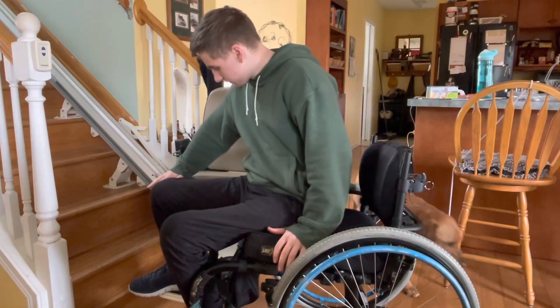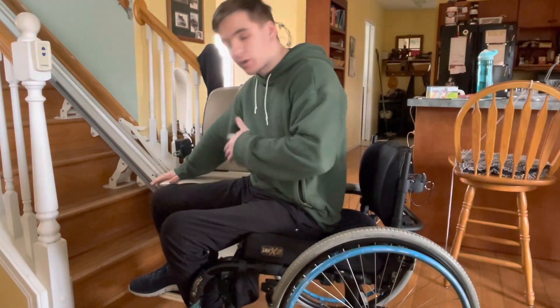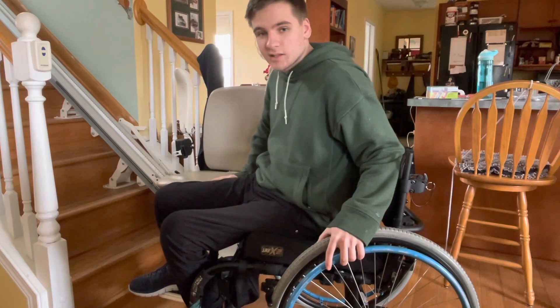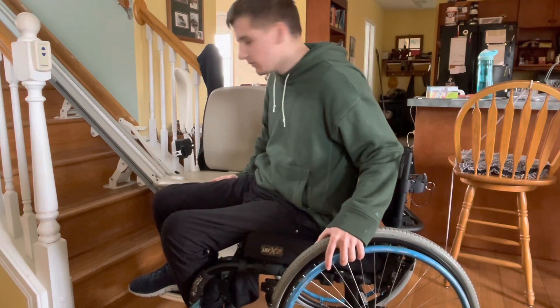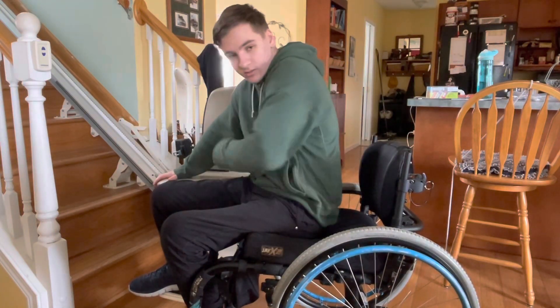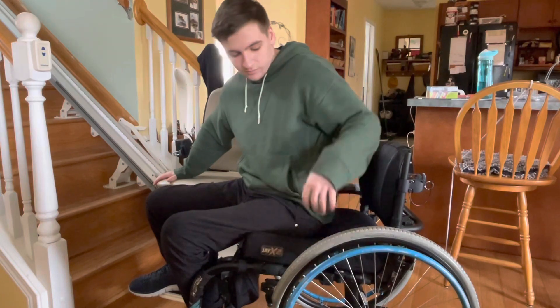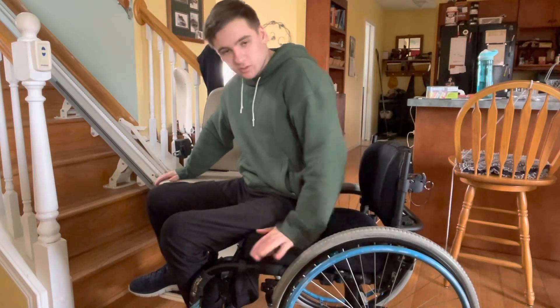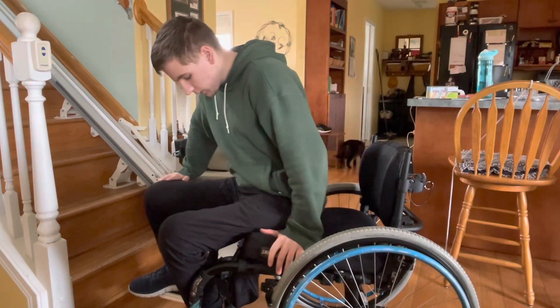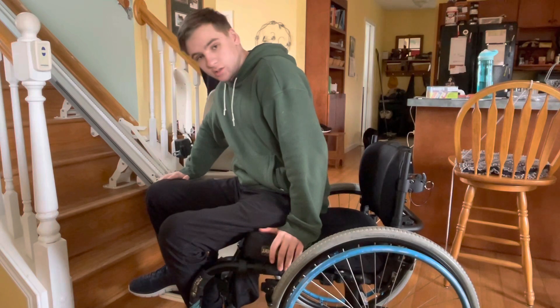In this example it's the opposite corner, but really it's just far enough away that you have a landing spot. I'm not going to put my hand right where I need to land because I can't transfer onto my hand. So I put my hand a decent ways over — you can see all the area that I can transfer to — and I put one hand on my seat cushion, wheel, or armrest if you have that. Really anything you can get leverage off of, it's kind of an individual thing. You get close and you're already leaning towards the chair.